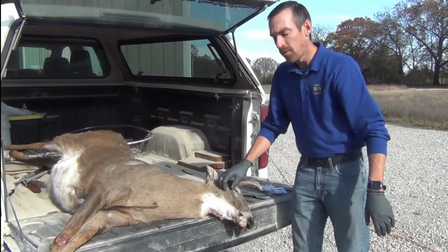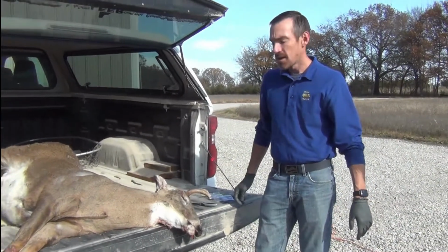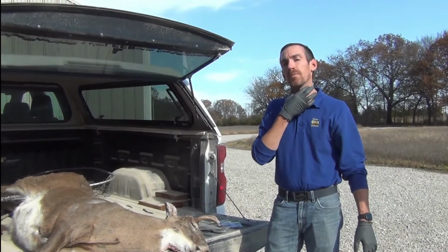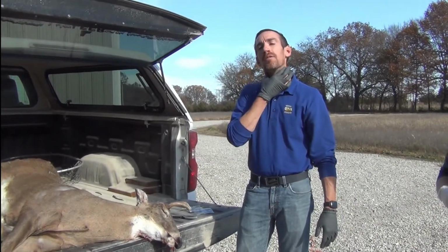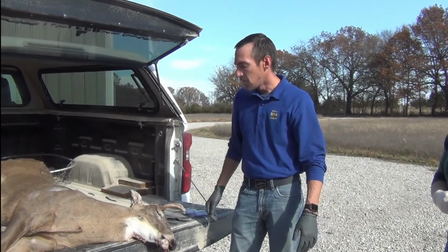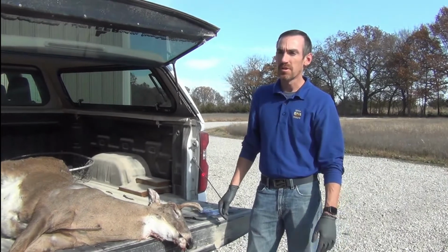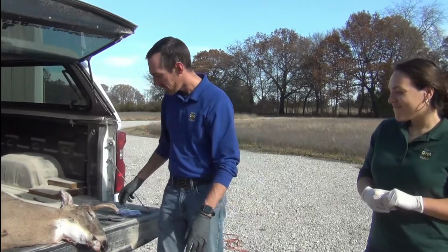So what we're pulling is what are called the retropharyngeal lymph nodes, which are the lymph nodes that you feel swell up when you might be feeling a little under the weather yourself, right under the jaw, right in your neck here. So those are the lymph nodes that we're looking for. I'll make the cut. Dr. Rudin is going to step us through some landmarks that we're looking for as we're doing that.